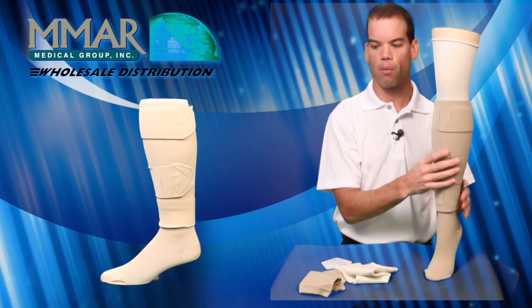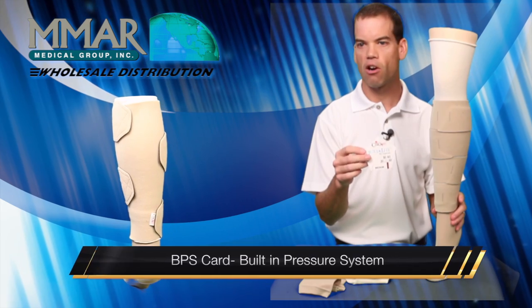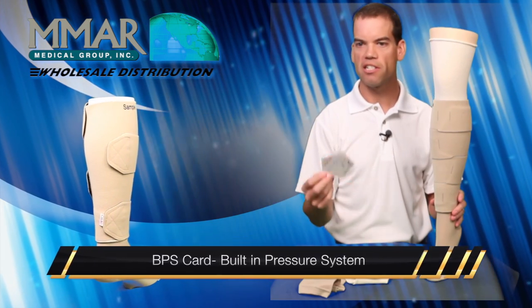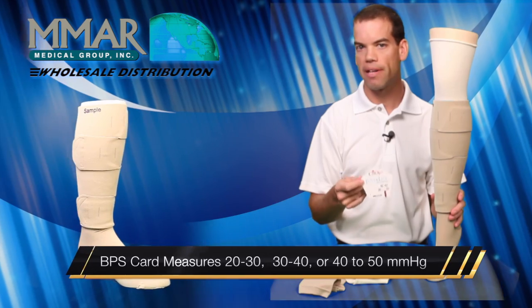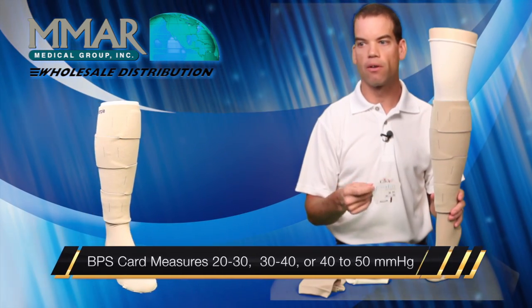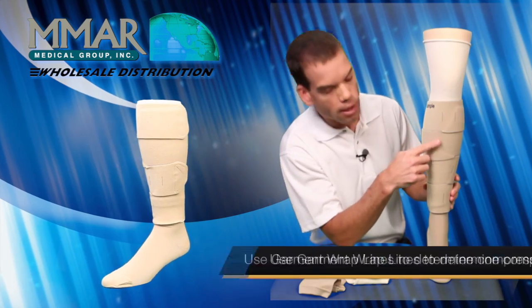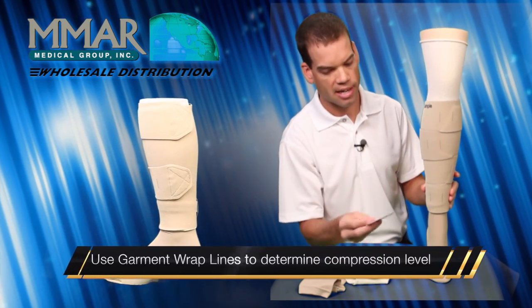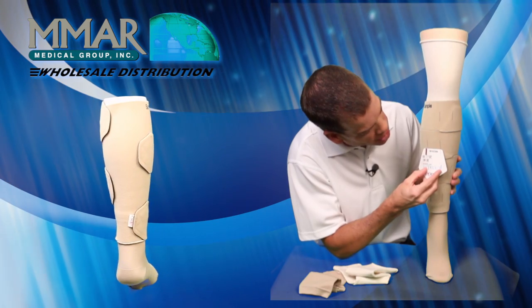The way the Juxtalite works is it comes with something called a BPS card — a built-in pressure system. You use this card to measure 20 to 30 millimeters of mercury, 30 to 40, or 40 to 50. You can see on the little wrap lines here — and I'll show it to you in a second — you place it and it tells you the level of compression.